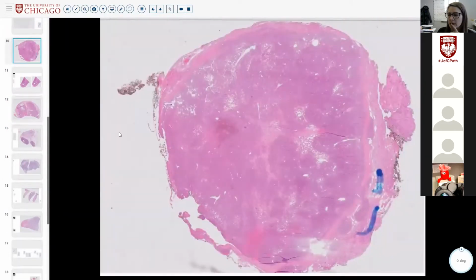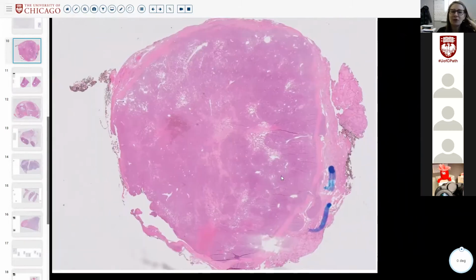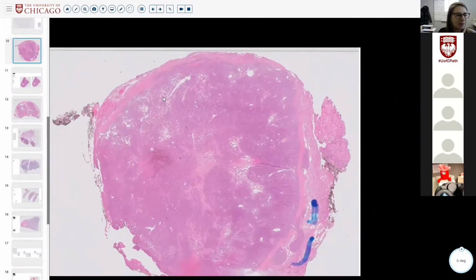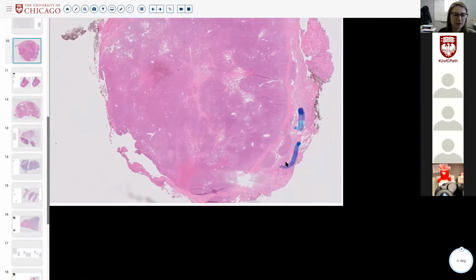Okay. Next. Well, the dots tell you the answer. Little things poking out from the capsule there. So, without belaboring the concept, now we're jumping back to follicular neoplasm. Sorry about the disorganization, but this is a thyroid nodule, right? That has a capsule that has a perfect poke or mushroom through the capsule. So capsular irregularity versus invasion.